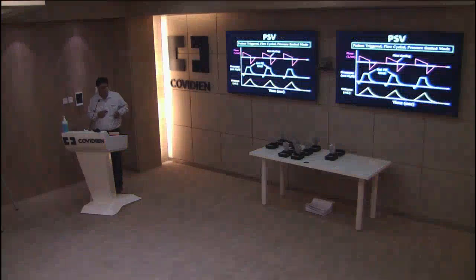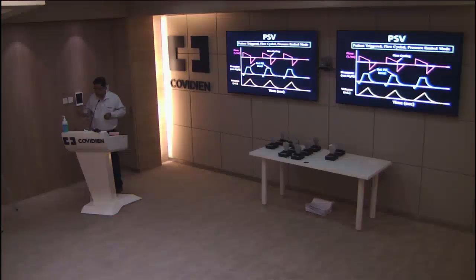Then, of course, we have pressure support ventilation. Now, remember, a lot of people tend to think that pressure support ventilation is a weaning mode. It is not a weaning mode. It is another mode of ventilation. Everybody thinks that you have to wean, change from whatever control mode or assist control mode, to pressure support. I don't know why. It is just another mode of ventilation. Weaning can be tried on many modes that they are on. You don't have to change to pressure support to then try and wean. Probably that will be talked about in the afternoon. I won't talk too much about that. But pressure support is another mode of ventilation.